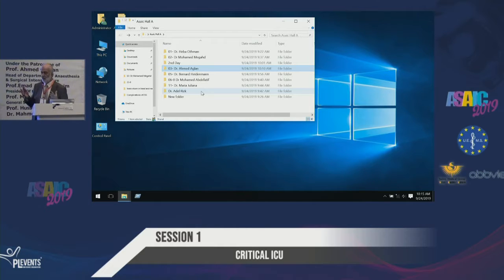Excellent. As I had mentioned, volume controlled, or volume assured control, or pressure target volume control, when you put the word volume, you are stuck to 2 points. Fixed flow, which will be rectangular, and at the same time fixed at that volume. The effort of the patient has nothing. It is a wasted effort. That's why I don't like it. And for a long time, it's not a good mode to put the patient on the ventilator, SIMV volume. You have to escape from it, except if the patient is paralyzed or heavily sedated.